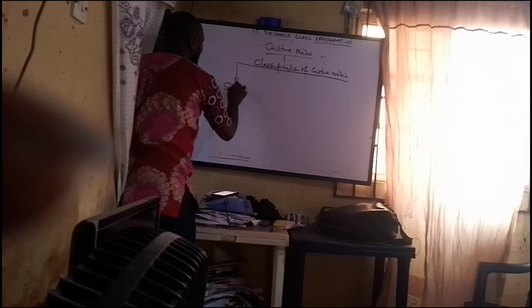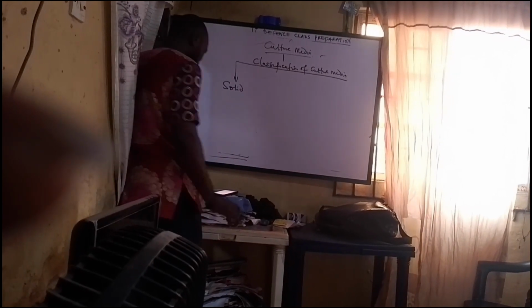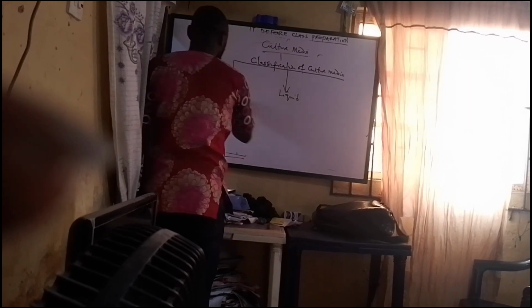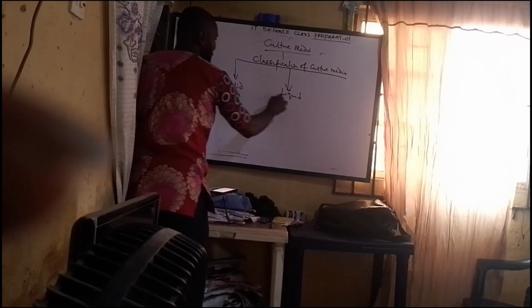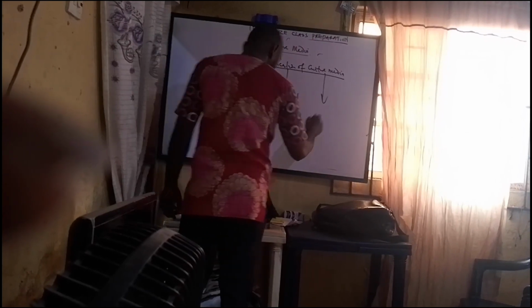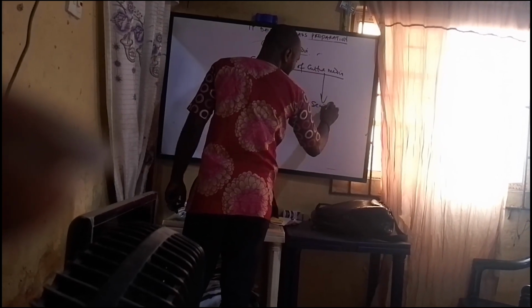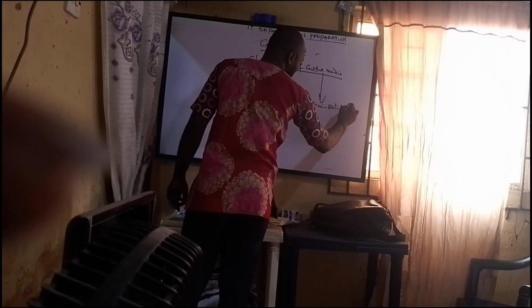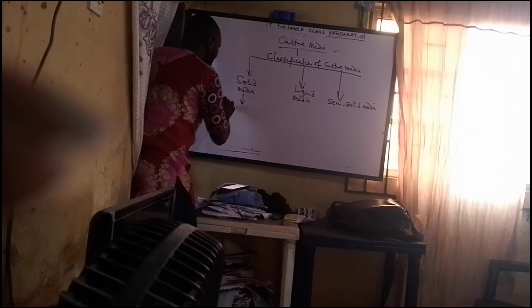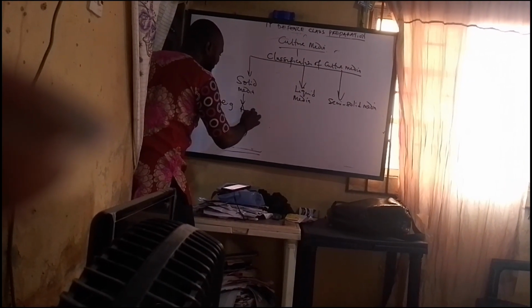Now we have solid media, we have liquid, and we have semi-solid media. So, example of solid, you now say e.g. agar.